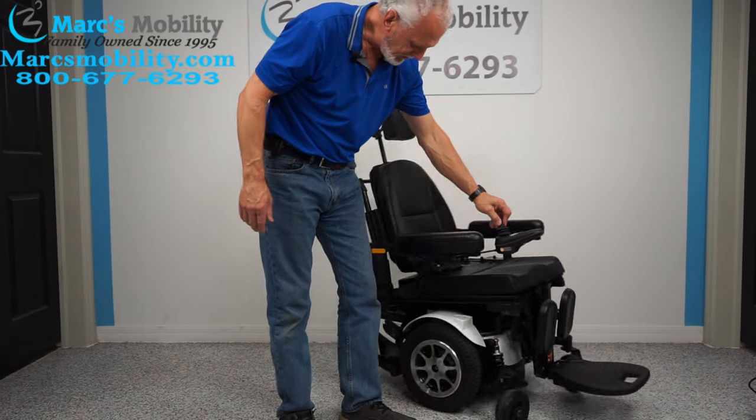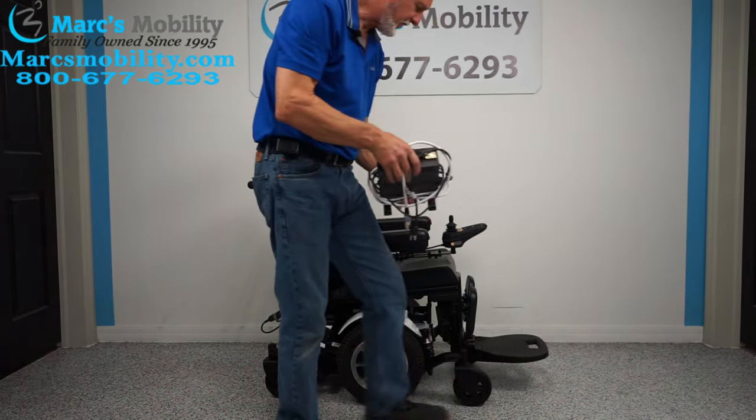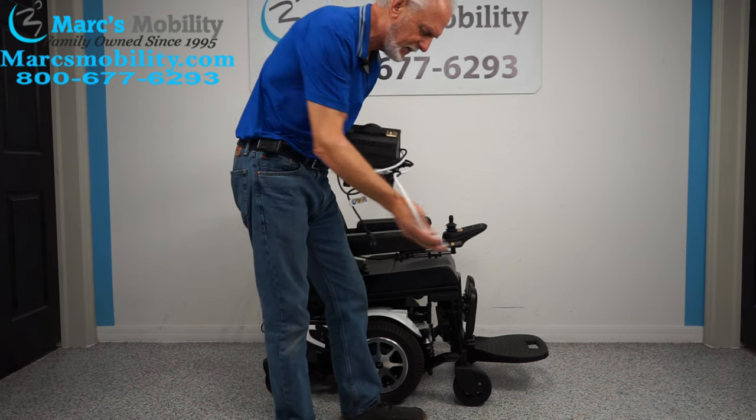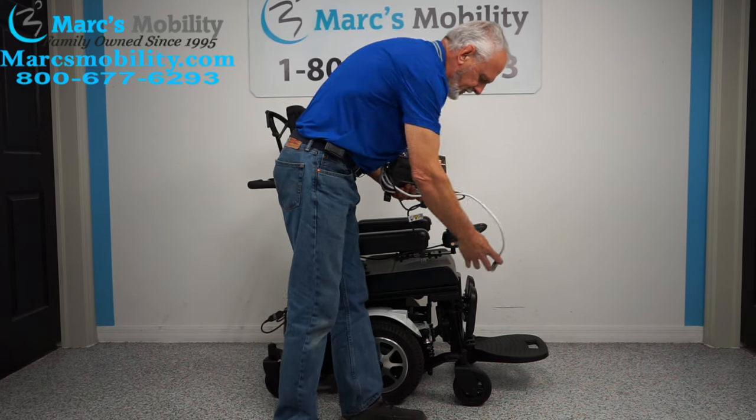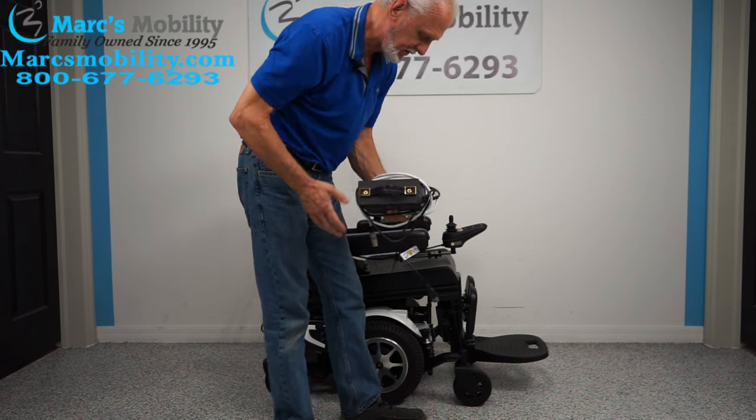When you charge the batteries in this chair, you plug the charger right here. As soon as the light turns green on your charger, you're fully charged.